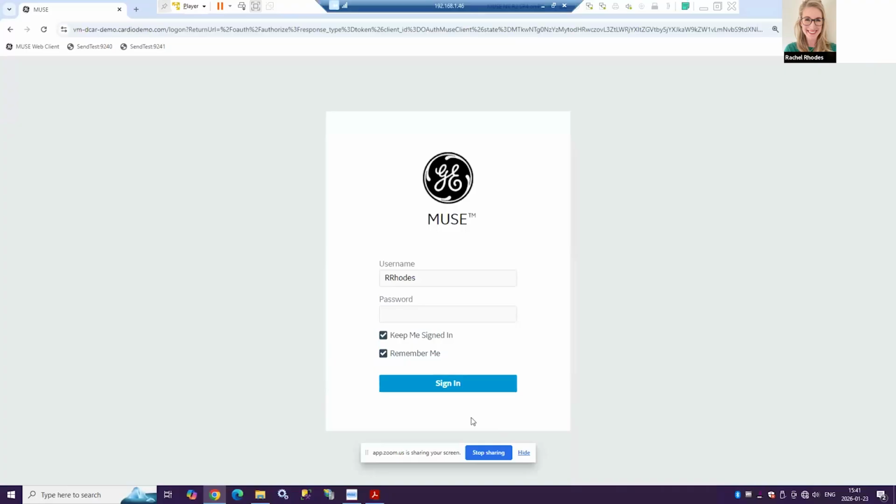So that's a bit of an overview of the MUSE web client. I'm very happy to take questions if anyone has any. Thank you very much, Rachel.